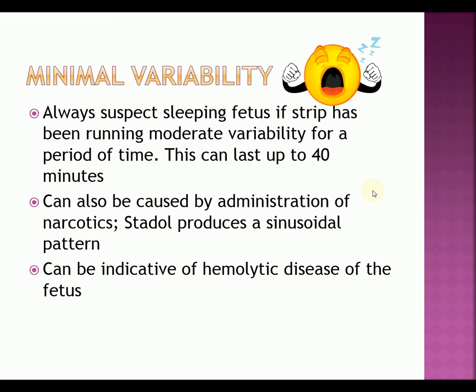Usually you will suspect a sleeping fetus if your strip has been running along just perfectly fine. It has good moderate variability, and then all of a sudden it has minimum variability and nobody did anything. Baby just got tired and decided to go to sleep.